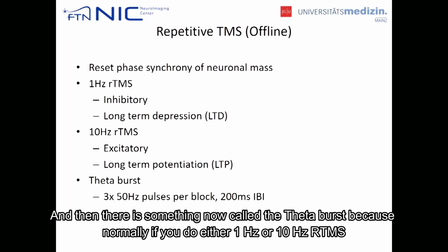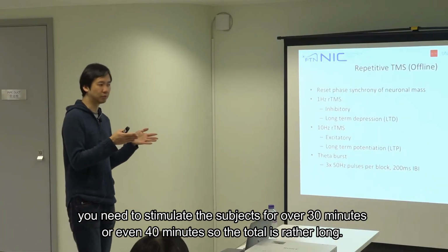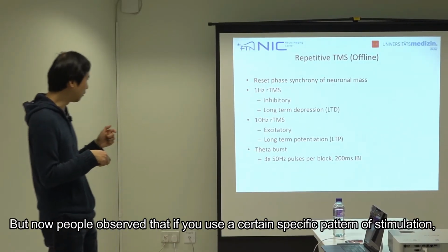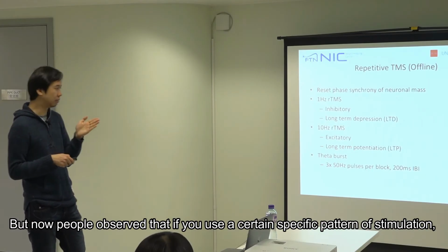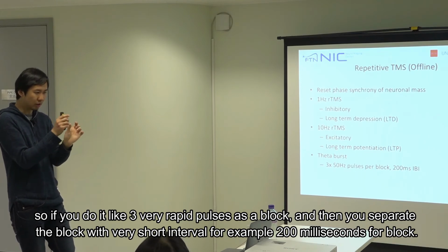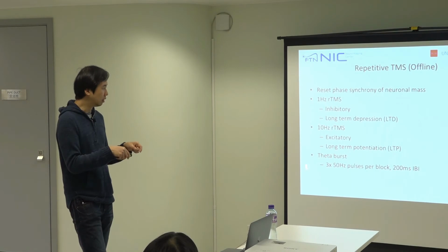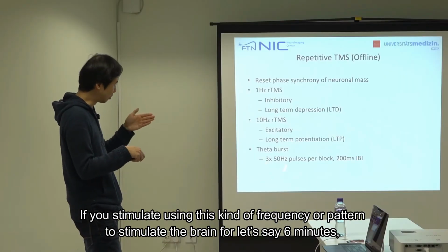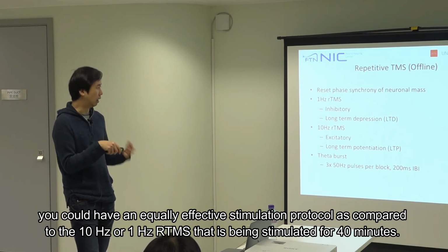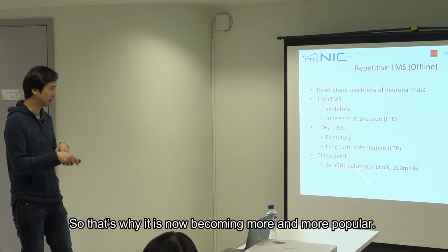And then there's something now called theta burst, because normally if you do either 1 Hz or 10 Hz rTMS, you need to stimulate the subject for over 30 minutes or even 40 minutes. So the protocol is rather long. But now people observe that if you use a specific pattern of stimulation, like 3 very rapid pulses as a block, and then you separate the blocks with a very short interval, for example 200 milliseconds, and stimulate the brain with this pattern for, let's say, 6 minutes, you could have an equally effective stimulation protocol as compared to 10 Hz or 1 Hz rTMS stimulated for 40 minutes. So that's why it is now becoming more and more popular.